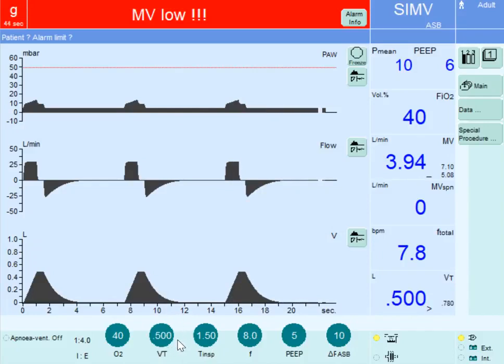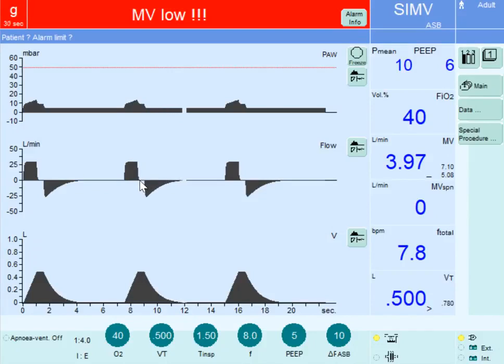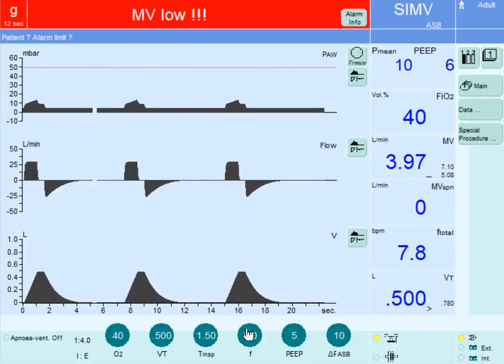Since we can deliver 0.5 liters of air at 30 liters per minute in only one second, there is a plateau of 0.5 seconds during which the flow is zero and the volume is constant after delivering 500 ml into the lung. The pressure required to maintain that volume inside the lung is the plateau pressure. Once the 1.5 seconds have elapsed, expiration starts, and you can observe the expiratory flow.